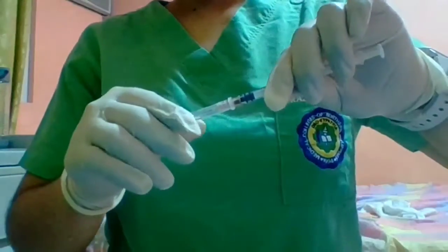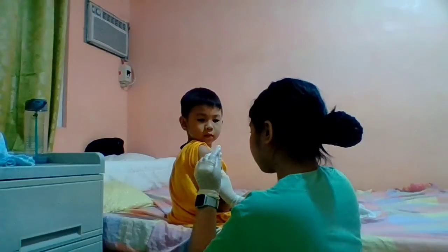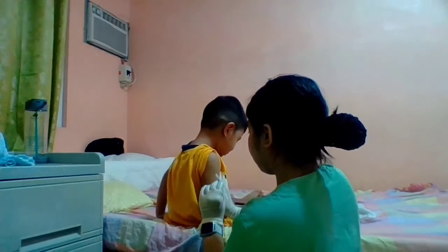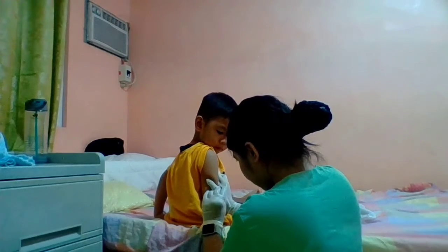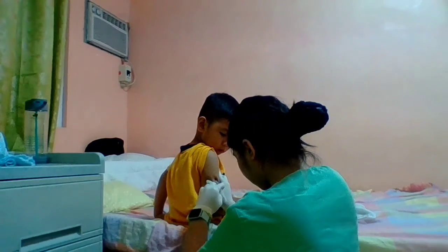Remove the needle cap with the non-dominant hand by pulling it straight off. Grasp and bunch the area surrounding the injection site or spread the skin taut at the site. Hold the syringe in the dominant hand between the thumb and forefinger. Inject the needle quickly at a 45 to 90 degree angle. After the needle is in place, release the tissue.